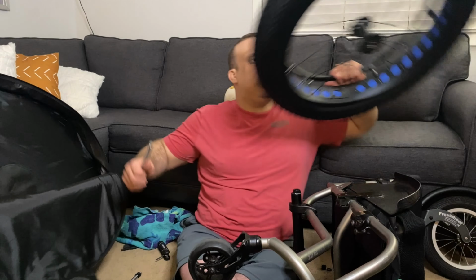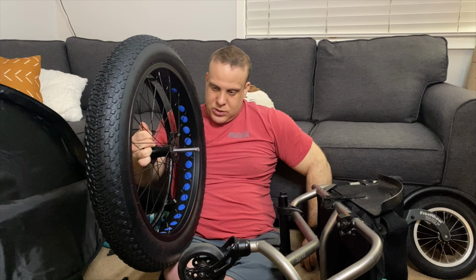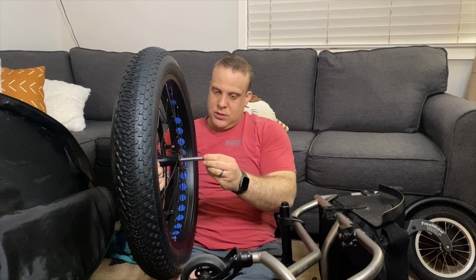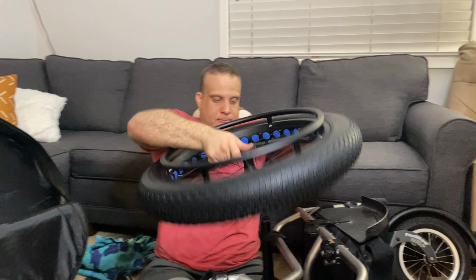So we will get the wheel over here. And the spacer's going on the inside, so we'll go one spacer, push it on, and then the last two.